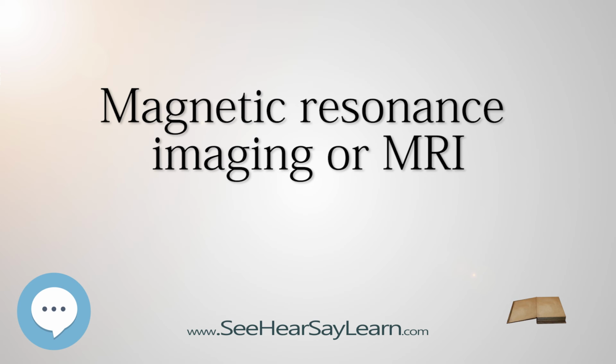Overuse. Medical societies issue guidelines for when physicians should use MRI on patients and recommend against overuse. MRI can detect health problems or confirm a diagnosis, but medical societies often recommend that MRI not be the first procedure for creating a plan to diagnose or manage a patient's complaint. A common case is to use MRI to seek a cause of low back pain. The American College of Physicians, for example, recommends against this procedure as unlikely to result in a positive outcome for the patient.